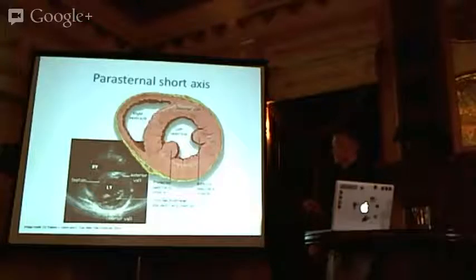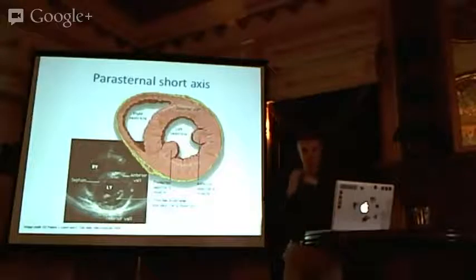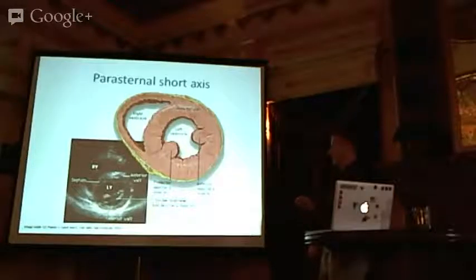And the right ventricle is thin, wrapped around it, a bit like a Chinese salute, so you've got a thick left ventricle with the thin right ventricle around it. This low pressure, thin wall right ventricle, if it's under a higher pressure, for example, in massive or submassive PE, is going to push on that septum and flatten it. That can actually make the left ventricle look like a capital D rather than a circle. So that would be a feature of right-sided pressure overload and flattening of the septum.